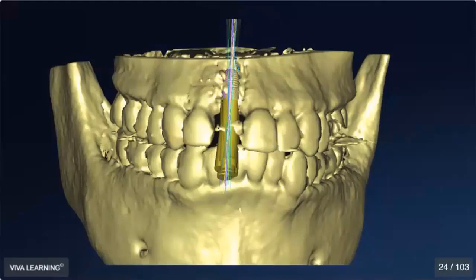So the first is placing an implant on a CBCT scan only, which a lot of practitioners will do: take a CBCT scan, look at it, decide where the appropriate implant placement would be, and then a lot of times do the freehand surgery afterwards. So in this case, single edentulous site, number 8, there are a number of implants planned under different strategies, and I'll explain what those are. But you can see from a mesial distal bodily position and angulation position, there's not a lot of discrepancy between these implants.